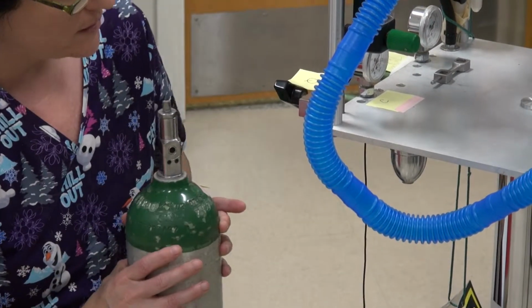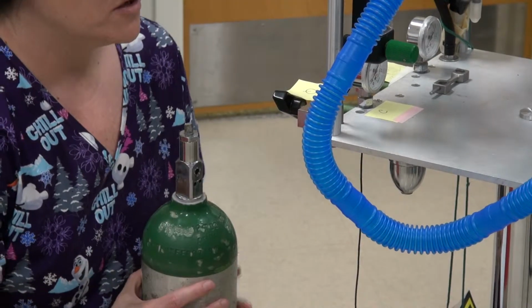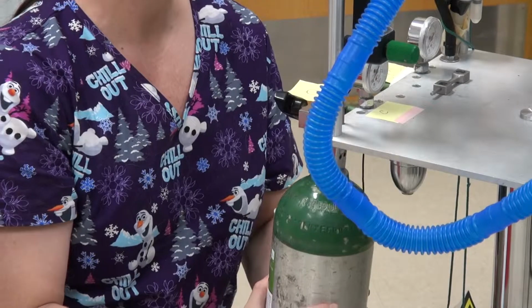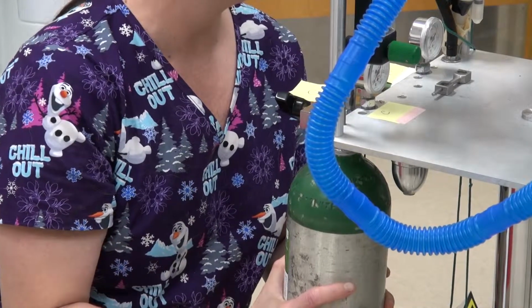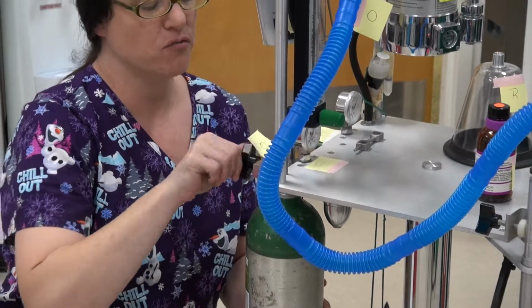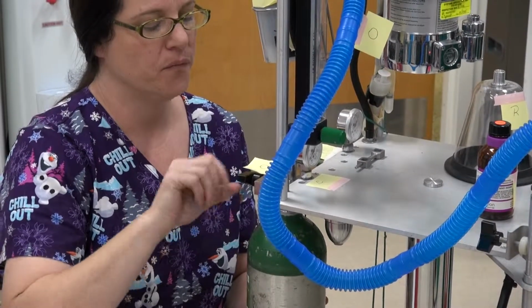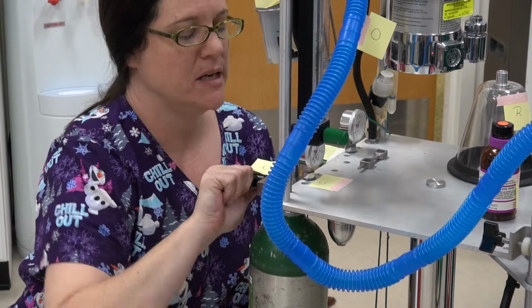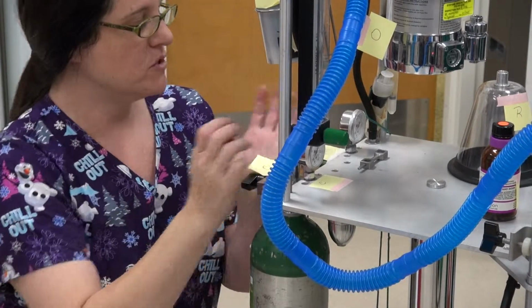You're going to gently just slide your E-tank up, like that, until you feel it slide into those holes, okay? Once you do that, it's which way? Righty tighty, right? And tighten our tank onto the machine.